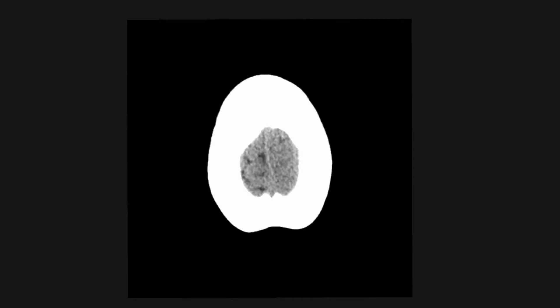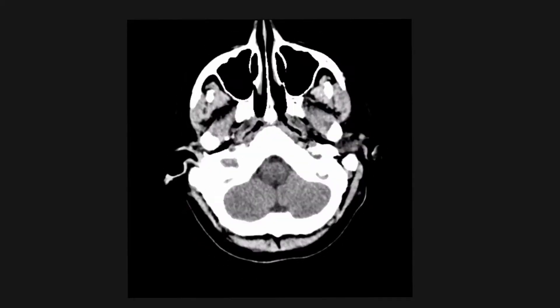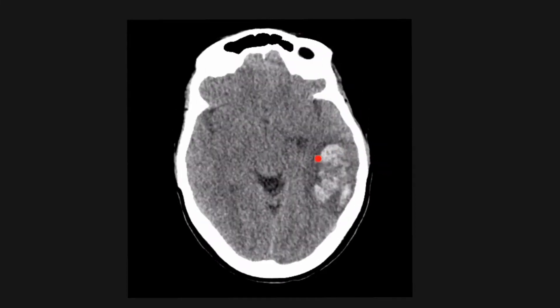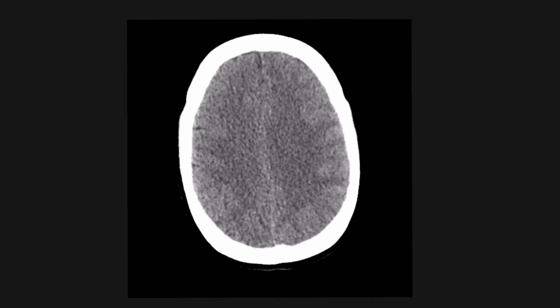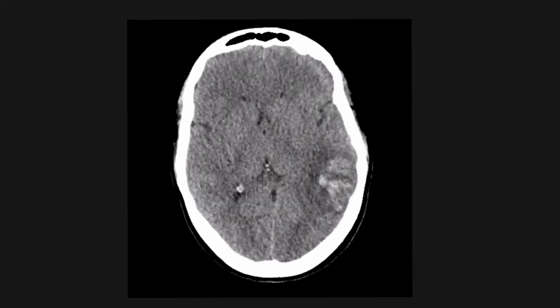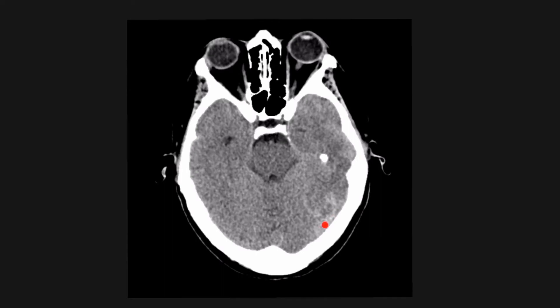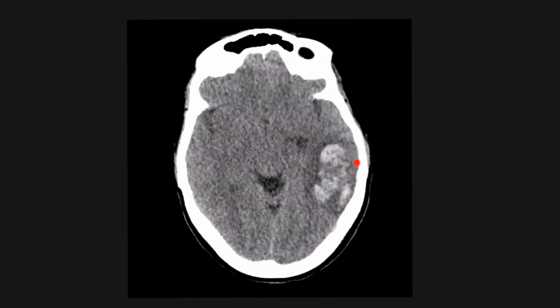Take a look at this last case. We can see that there is abnormal hyperdensity in the left temporoparietal lobe. This is not in a typical vascular territory. And when you look closer, you can see there is hyperdensity in the left transverse sinus. This is in keeping with an acute venous sinus thrombosis with associated haemorrhagic infarct.